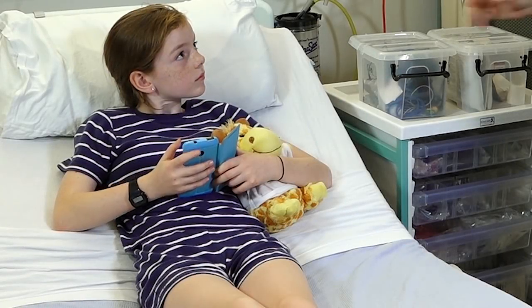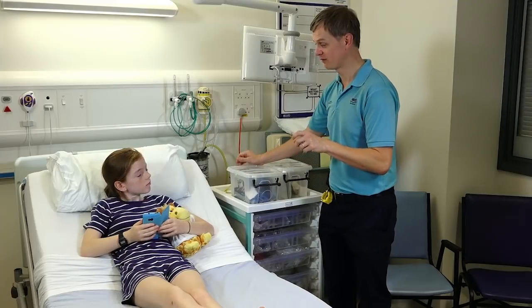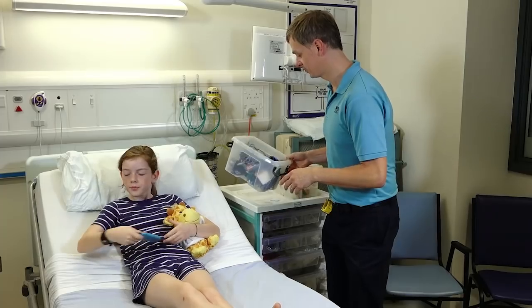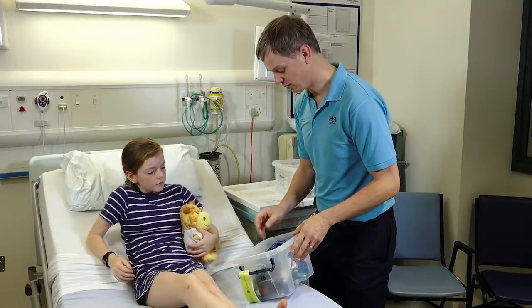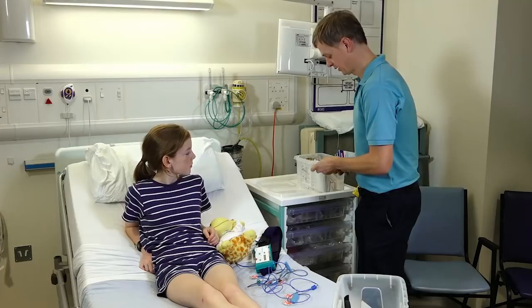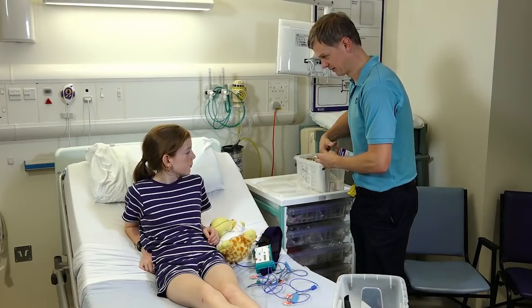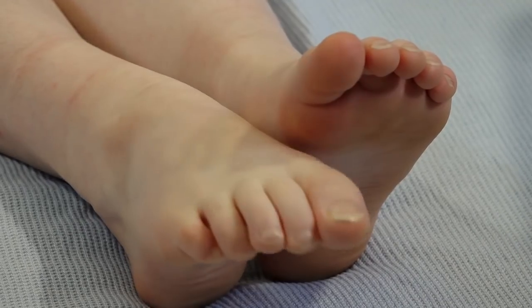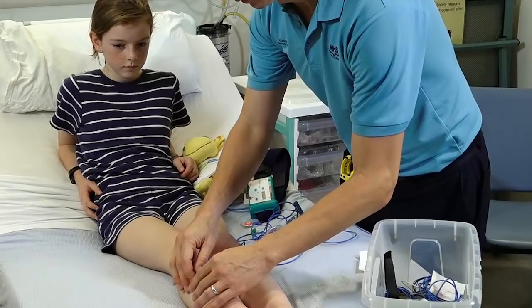I see you're ready for bed. When we're doing the test you need to have your phone off because it will stop you getting sleep and could also disturb the study — same goes for grandpa as well, no telephones please. These sensors are not going to do anything sore and a lot of them are just based on sticky tapes. You're not allergic to any sticky tape or adhesives, are you? Fantastic. We're going to put on about eight or nine sensors which are going to help us see what your breathing does.